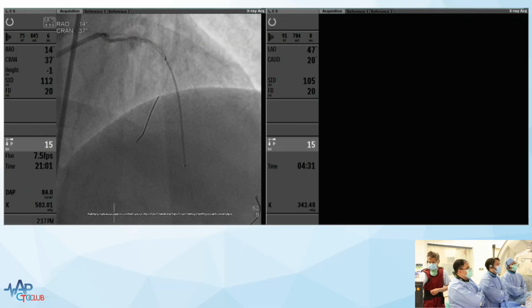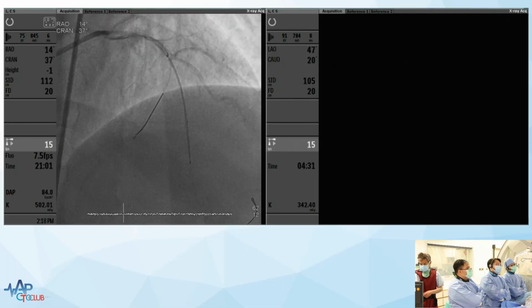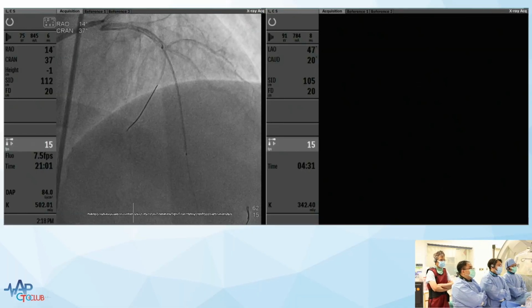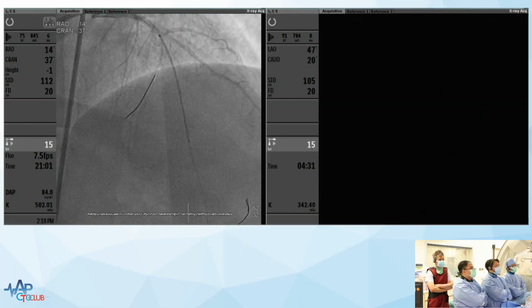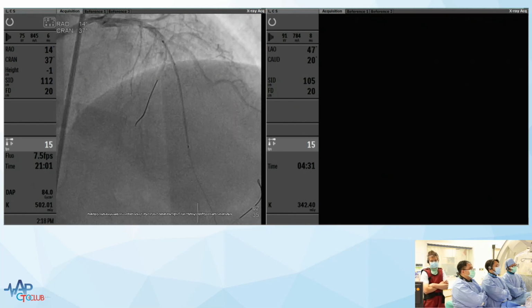And this is a 50 year old male. And I think rather than put a long stent in here, I would cut it, and I would see how it looked, and then DCB it. So maybe comments from the panel: who would stent, and who would DCB?